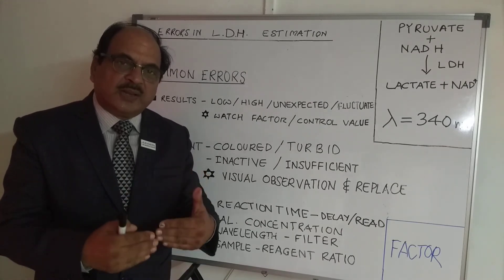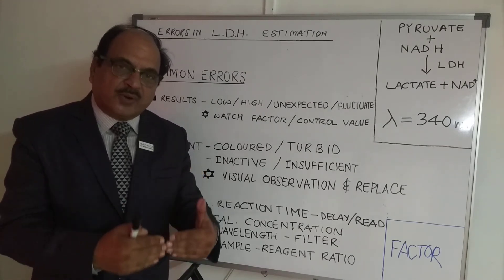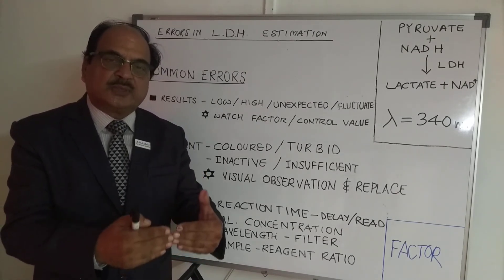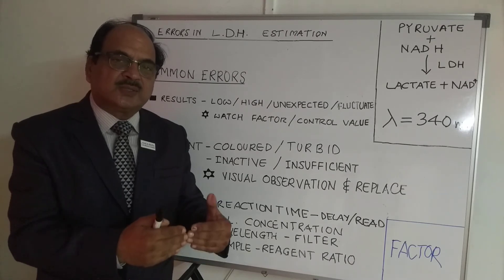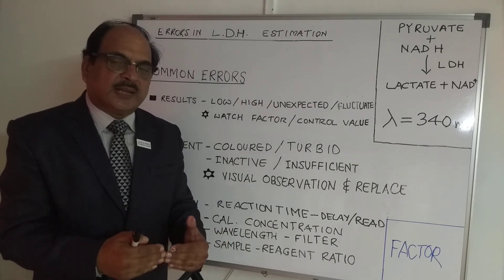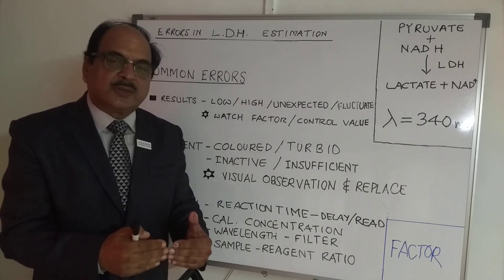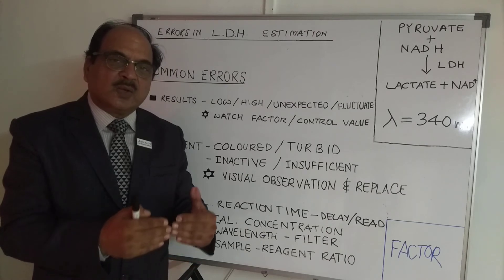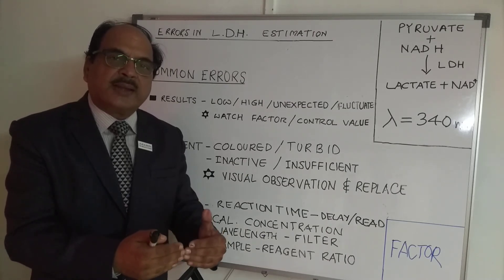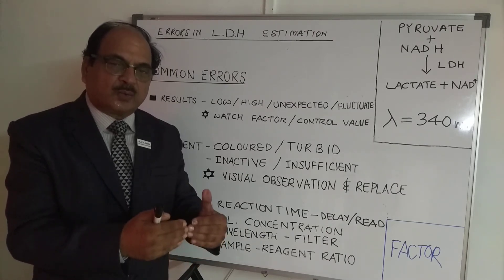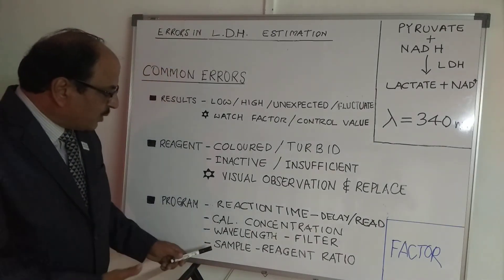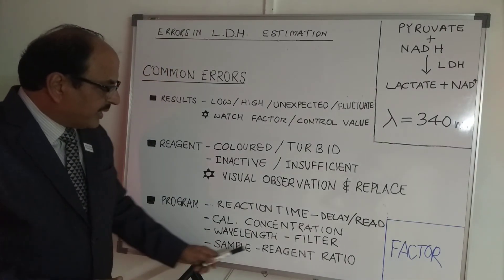Next is wavelength. The standard wavelength for LDH is 340 nanometers. Wavelength filters deteriorate over time as the instrument ages. Ensure that your instrument's 340 nanometer wavelength is well calibrated and functioning properly to get accurate results.